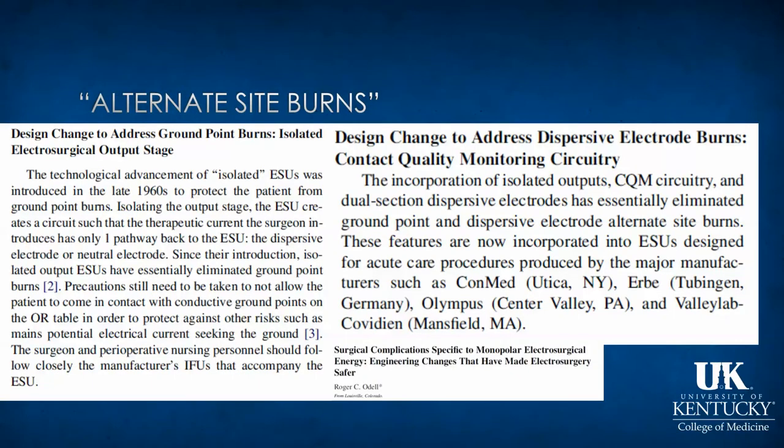So within this review, I did learn a few things again, which I want to share with you regarding the development of isolated ESUs and the design changes which were made to address ground point burns. In other words, the alternate site burns.